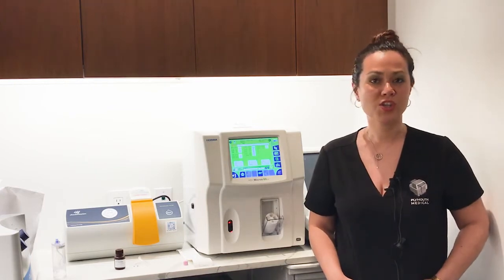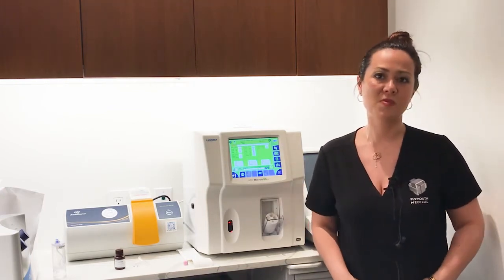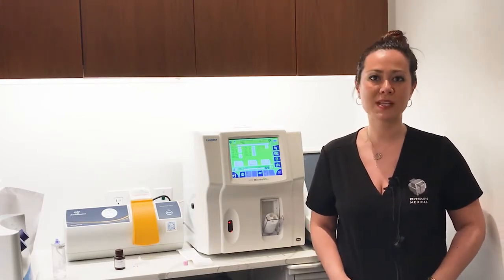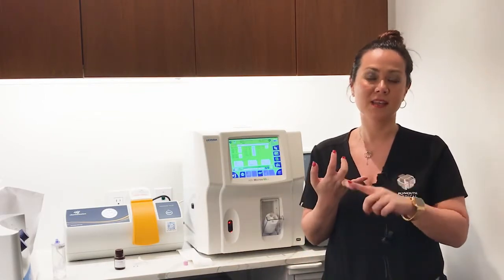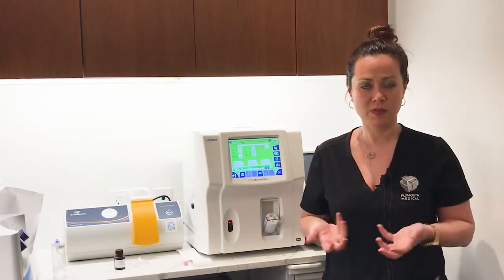Today we're going to do a little introduction on our Horiba Micros ES60. That's a hematology analyzer — specifically a three-part DIF hematology analyzer, which means it actually breaks out the total white blood cell count into monocytes, lymphocytes, and the granulocyte family, of which neutrophils fall part of.